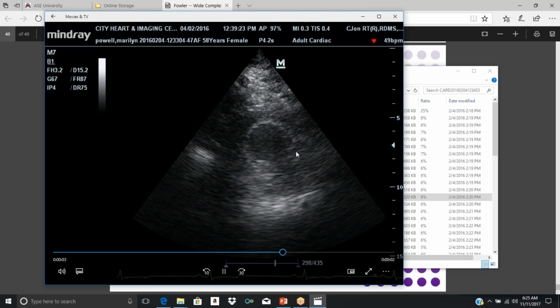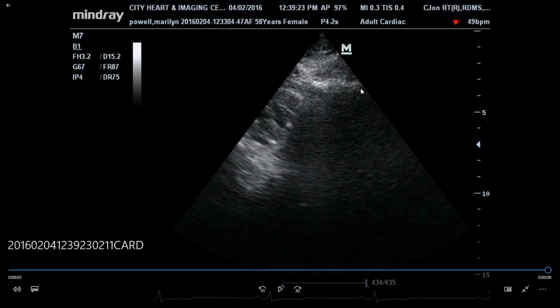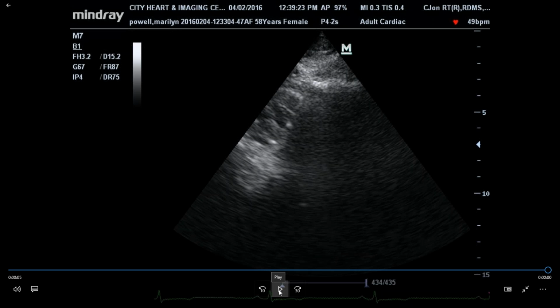So you're still at the base, and you're moving towards the papillary muscle. So where you have the papillary muscle, that's what we call the mid-cavitary level. So if you move from the aorta, short axis at the level of the aorta, you're gradually raising your transducer up.